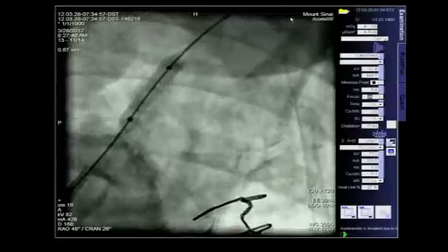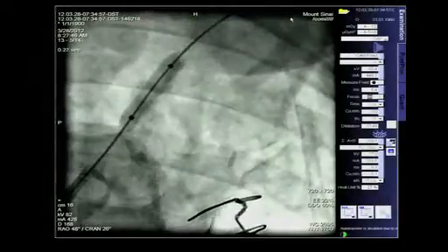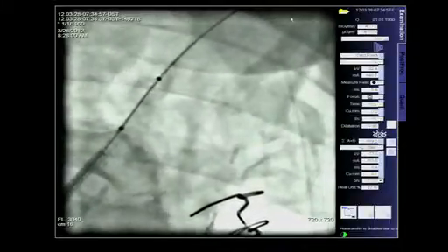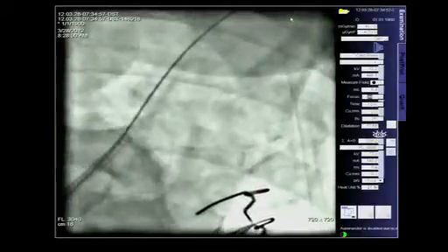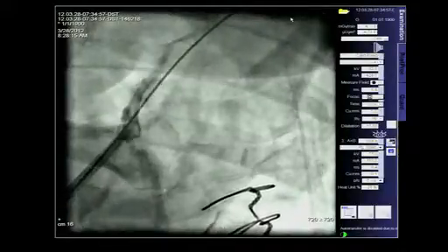Anyhow, I wanted to say that another aspect of a CT angiogram is the fact that we check the contralateral vertebral. Can you talk to us a little bit about the right vertebral in this case? And by the way, it would be good to put the sheath sometimes over the balloon.